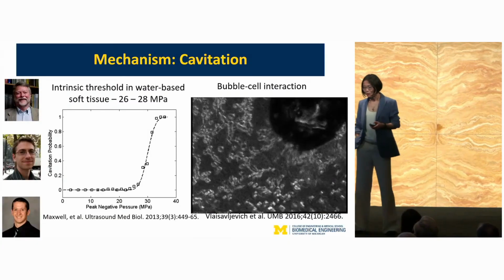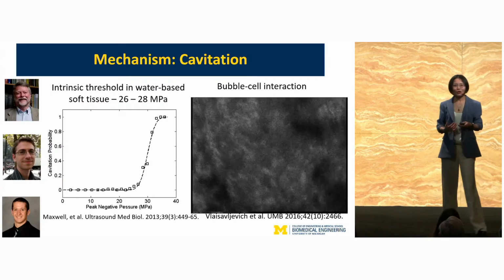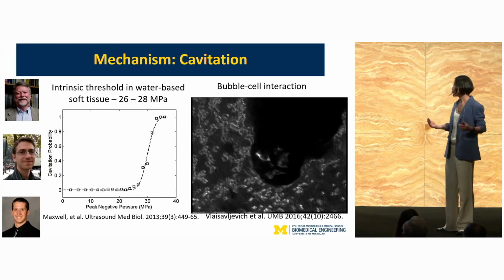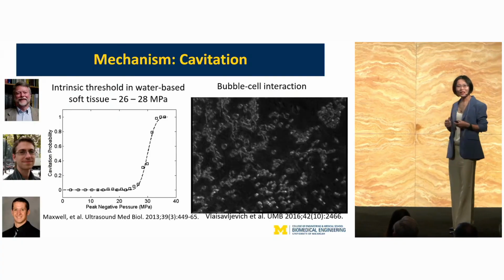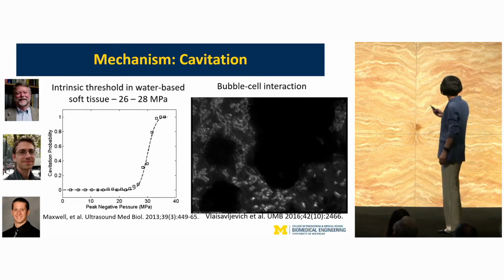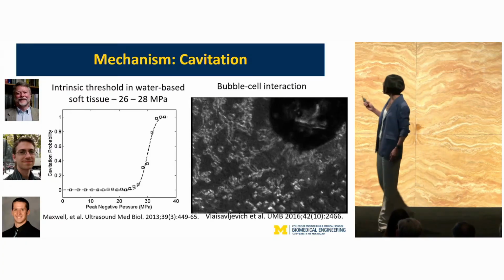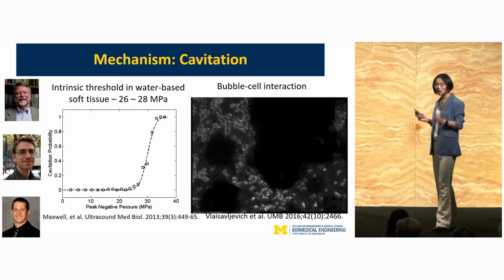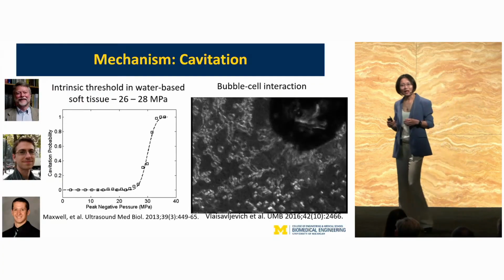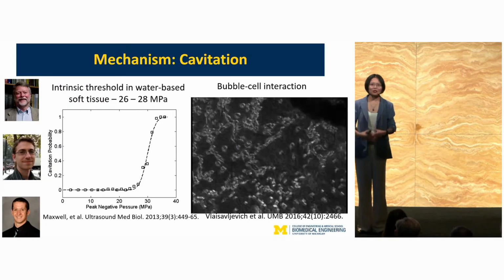Second, about the mechanism. If one thing is unknown for a scientist, it's opportunity. So what we did is we got an ultra high-speed camera and a microscope, and we started studying bubbles, how bubbles work. So what you are seeing here are the two critical things of the mechanism. The first thing is how bubbles, microbubbles, can be generated in a controllable and predictable fashion with ultrasound. So what happens is that we are breathing air, so we have nanometer gas pockets in our tissue because it's filtered by the lung.